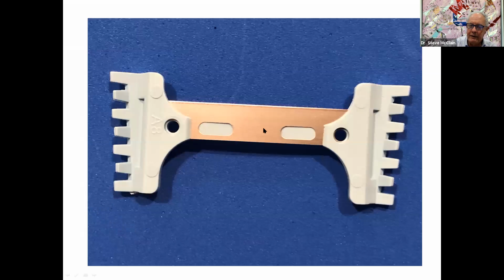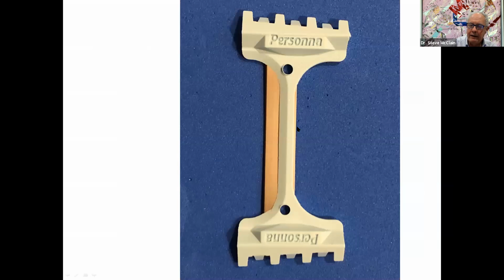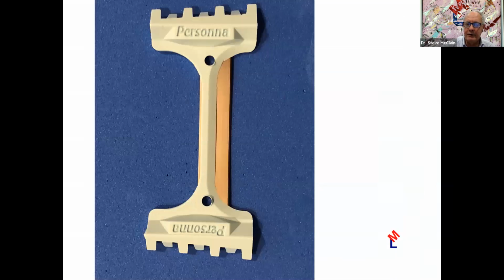This is the upside down. If you see it this way, this is upside down. If you're right-handed, you use it from this side. Look for the label, and then here's the sharp edge. Be careful of the sharps. You must control your sharps. If you're left-handed, you put it the other way, and this is operated between your thumb and third finger.